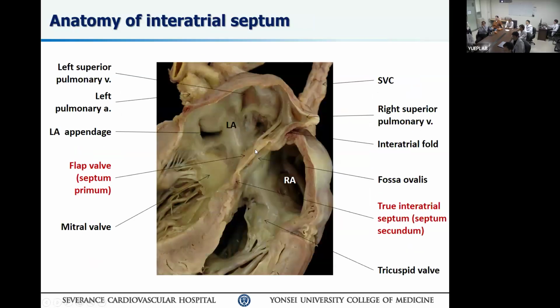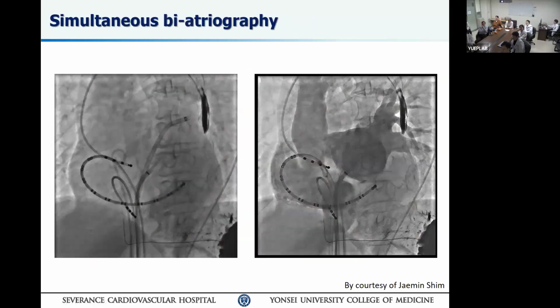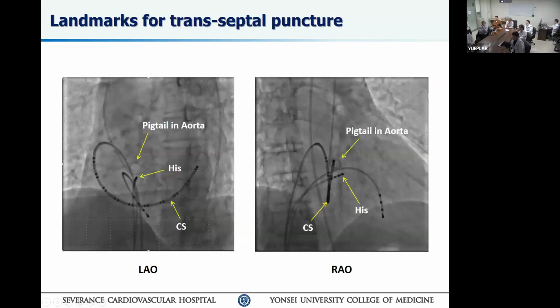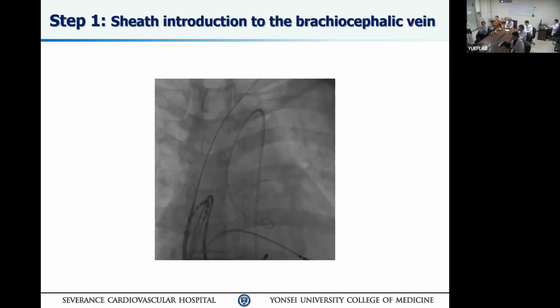Go next. Keep going. It's fine. Keep going. Yeah, you had a picture. No, keep going. This is where the needle is engaging the septum. Keep going. That's good. Okay, right here. You passed it.